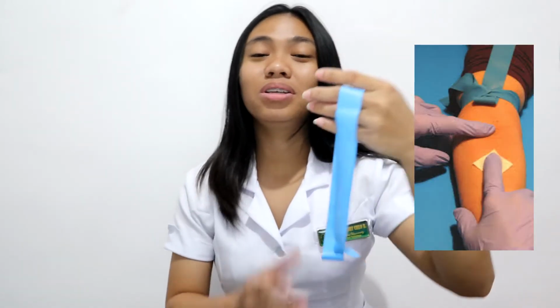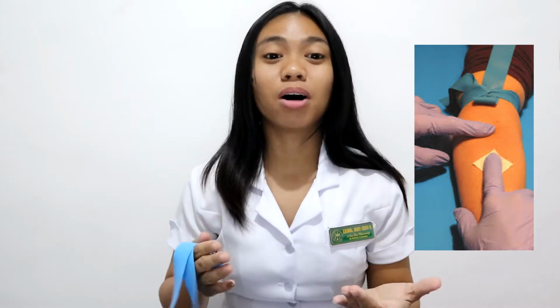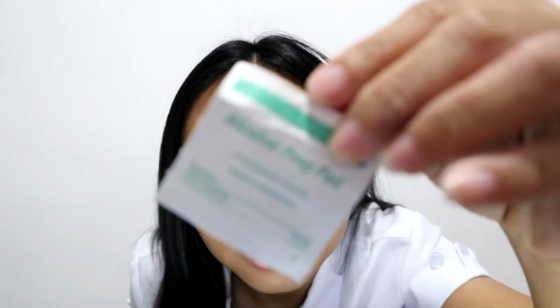This includes gloves and alcohol for the phlebotomist's personal protective equipment. Note that in a laboratory setting, a mask and laboratory gown will also be necessary. Next is a tourniquet. This tourniquet will squeeze the blood vessels of the patient for the phlebotomist to determine the location of a suitable vein for venipuncture. Then an alcohol prep pad. An alcohol prep pad, or simply cotton with alcohol, will cleanse the area where the venipuncture will be done.